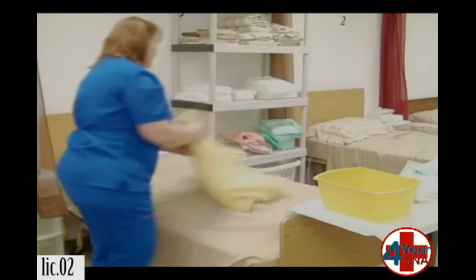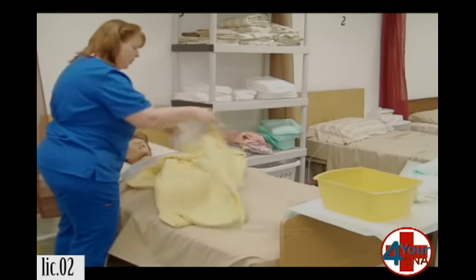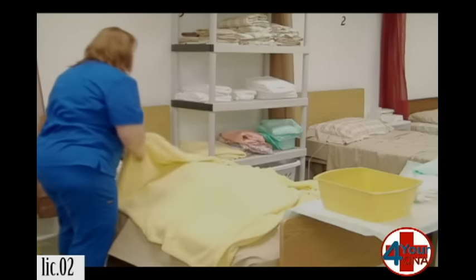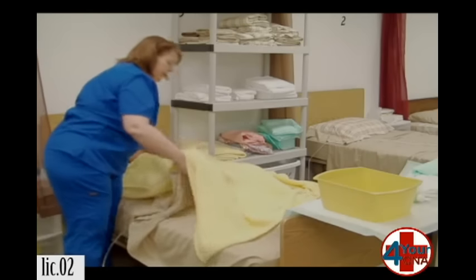I'm going to spread this privacy blanket out over you. This is going to help provide privacy and keep you warm while we complete the skill. Ms. Jones, if you can hold that blanket in place, I'm going to try to pull this sheet down to about your knees.